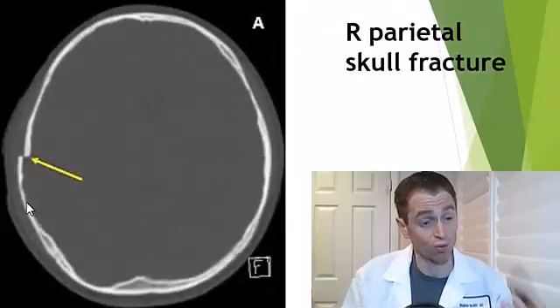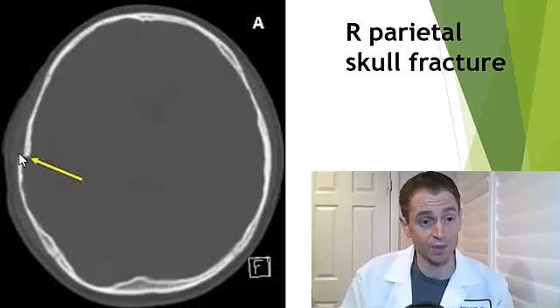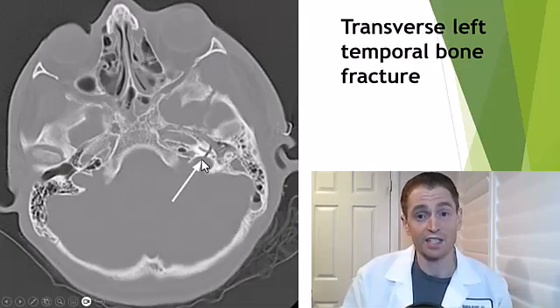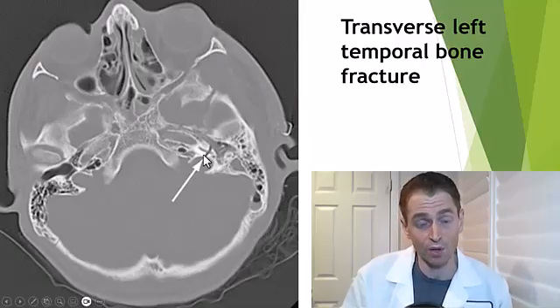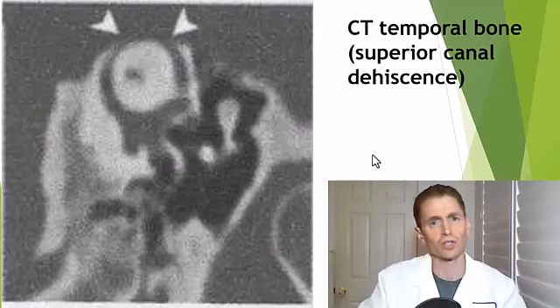CAT scans are also very good at looking at bone. Here is a parietal bone fracture on the right side with slight displacement. This is a transverse fracture of the left temporal bone — you can see a clear line going straight through the temporal bone.